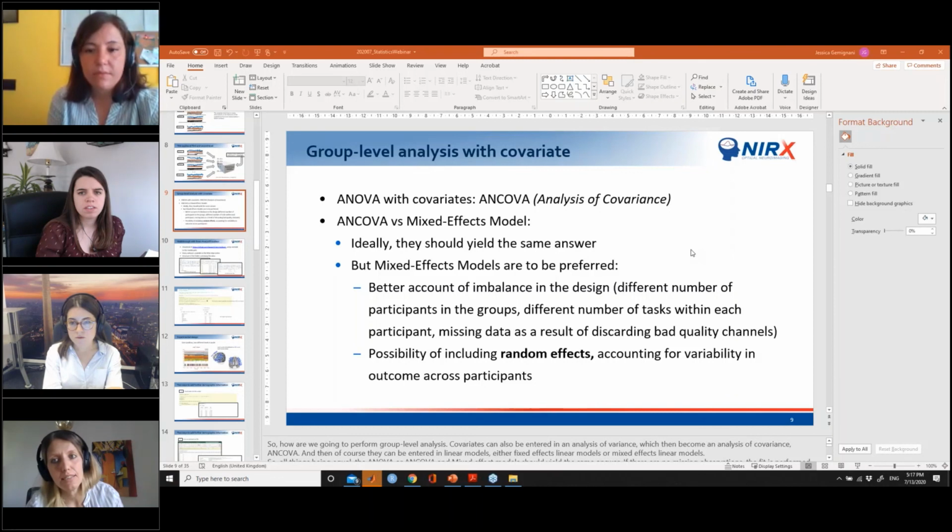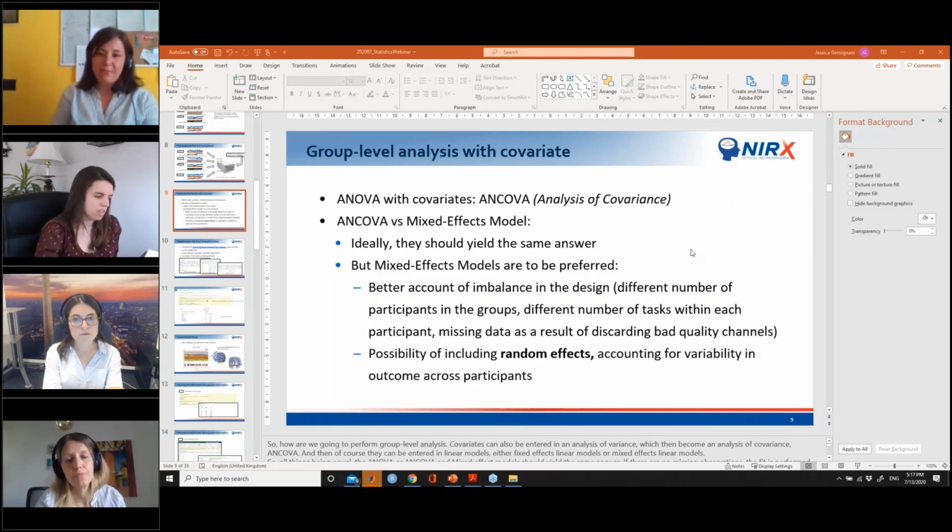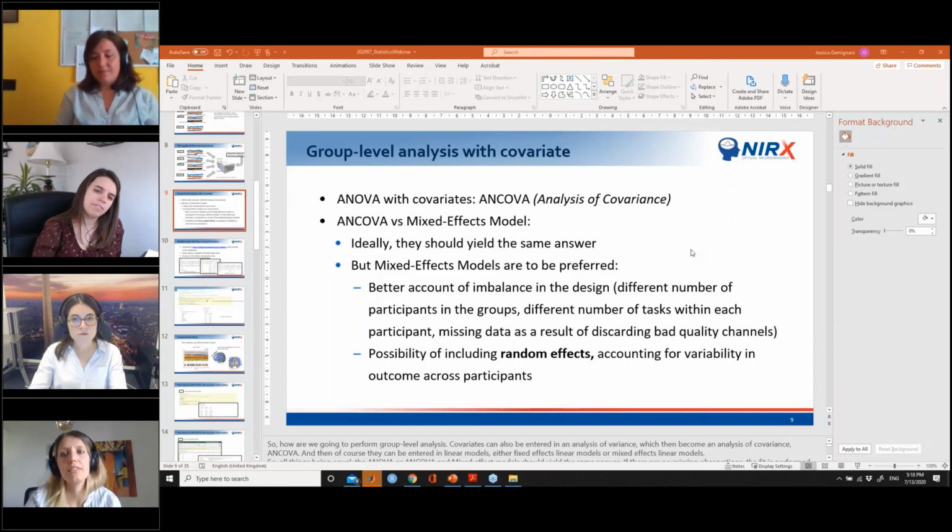I would actually adjust it even to each single subject. And I don't know, Jessica, what you think of that. But you could add age as a covariate for each subject, despite the fact that you use two groups. So definitely adjust it. Then for each single subject, we would have a different DPF and PPF value.